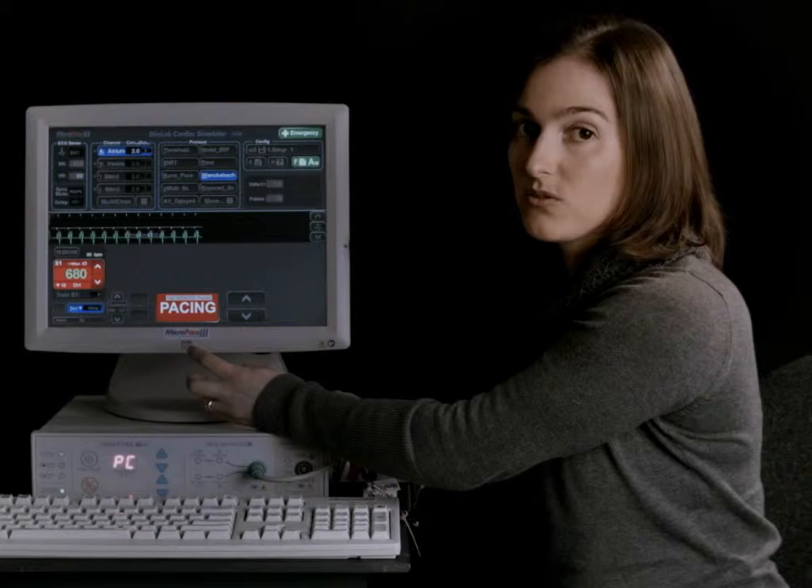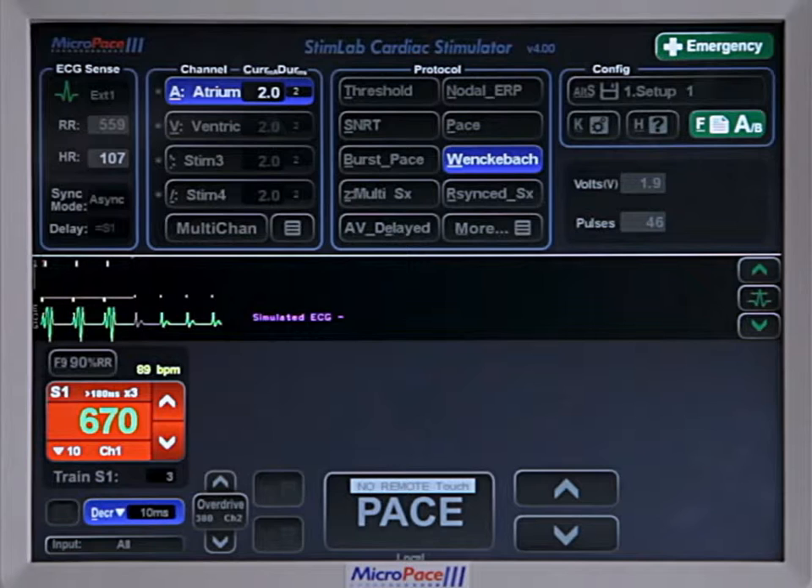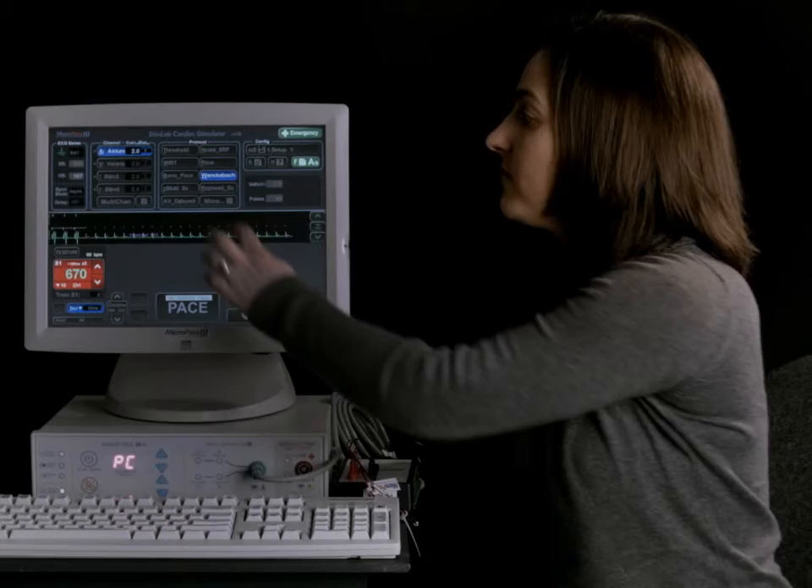Then you can decrease it again, like so, and just check that that is truly the Wenckebach position. Now this is a good compromise between a fully automated system and a manual system. Sometimes doctors prefer to just go straight for manual and not worry about the automated Wenckebach.